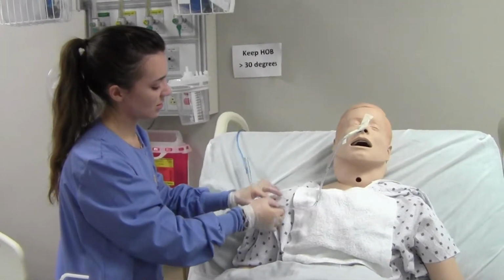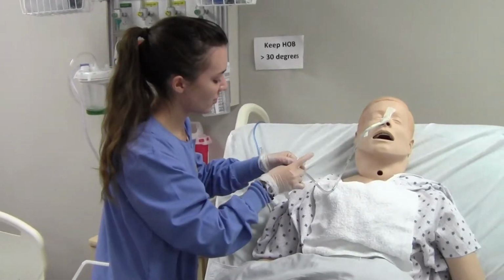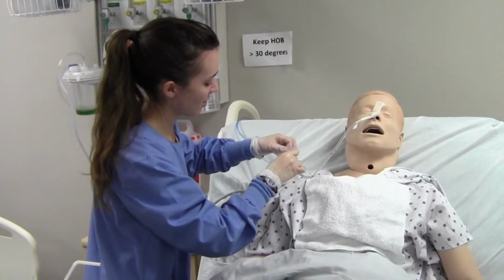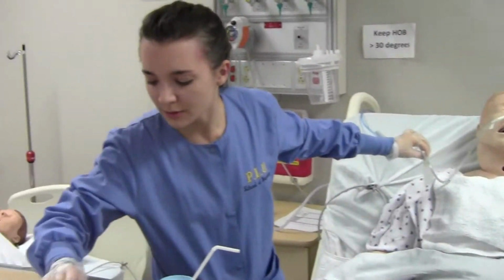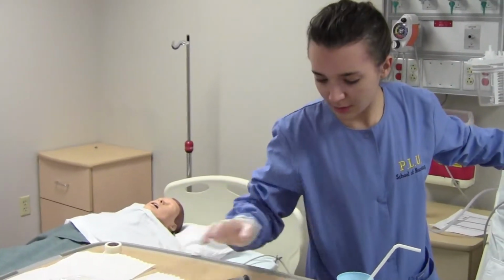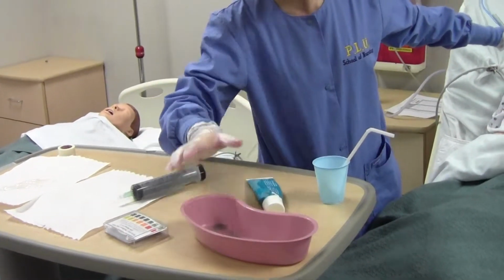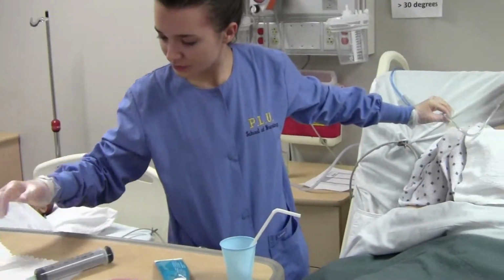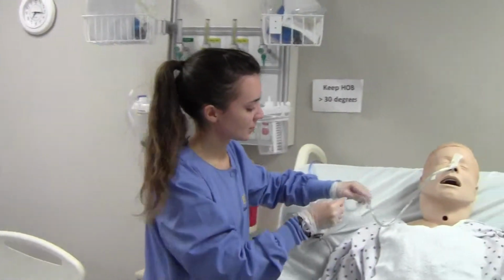Okay, Mr. Templeton, I'm going to secure this to your robe so that you can move around freely again without it coming out at all. Put this on here. I'm going to grab our pin. Which one did I put my pin? Just have my pin. There it is.